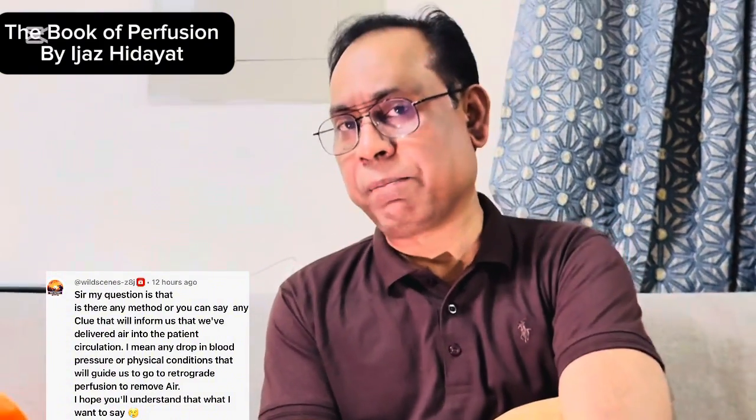Now, there are two types of circuit. Number one is a closed circuit, and number two is an open circuit. Open circuit means like cardiopulmonary bypass. Closed circuit means like ECMO circuits, so there is no opening in between. Like in cardiopulmonary bypass, we have the reservoir and there is an opening. So this is an open circuit.